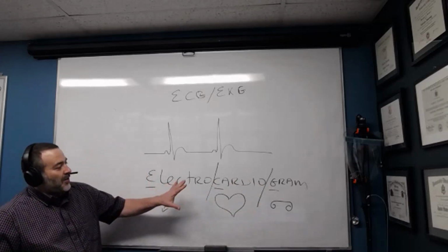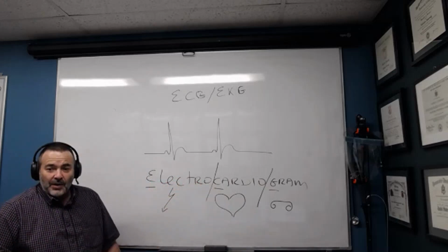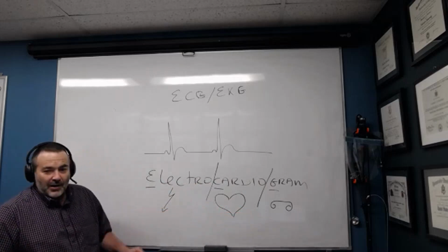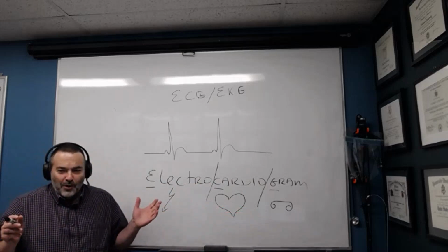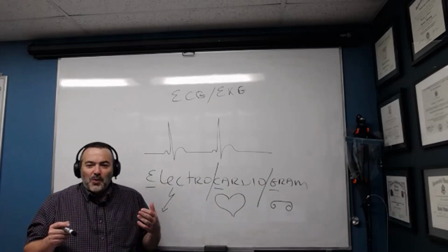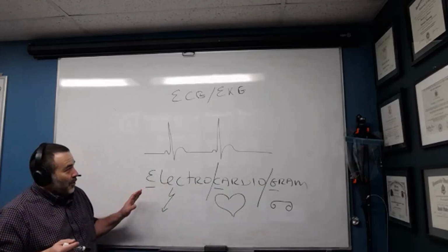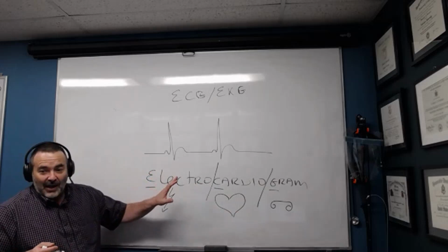So what is the meaning of the word electrocardiogram? Well, the word electrocardiogram simply means a recording of heart's electrical activity. And that's an important key to your understanding what ECG or EKG is all about. First things first, need to understand the language.